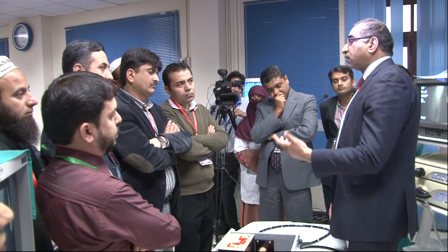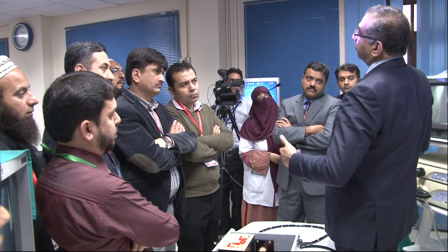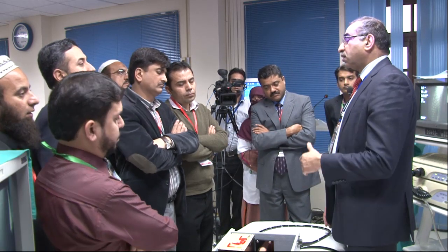Sometimes if it is a difficult situation, like you've got a J-shaped stomach or a big hiatus hernia, then it's better to keep them propped up on their side. And once you are through the pylorus, then you can put them in the semi-prone position, right?